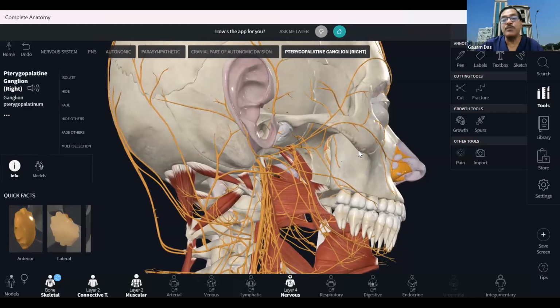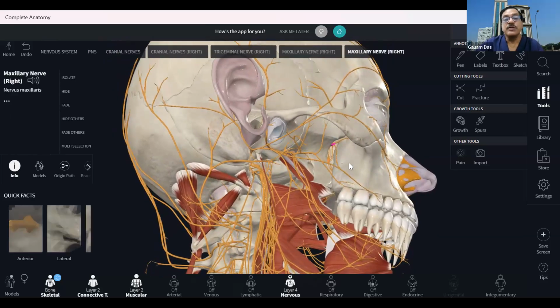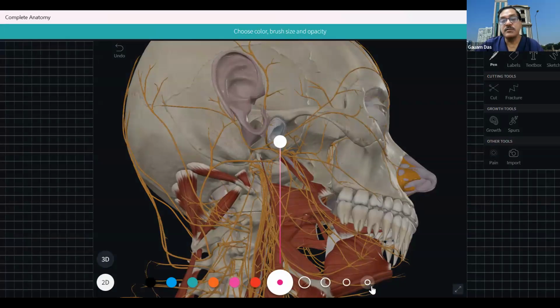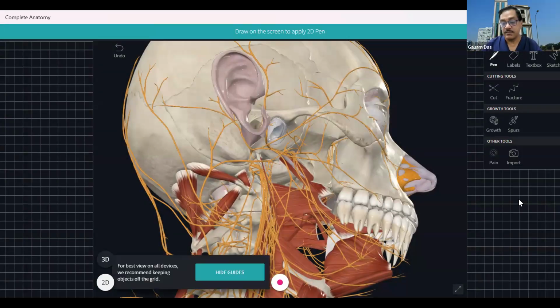This is basically hanging from your maxillary nerve. So this is the fossa. This ganglion, if your needle comes into it, I'm just showing you the needle trajectory. If your needle is coming like that, this is your maxillary nerve block and this is your sphenopalatine ganglion block.